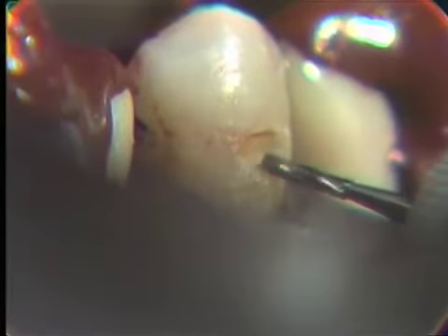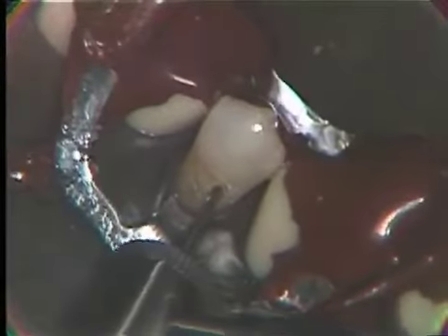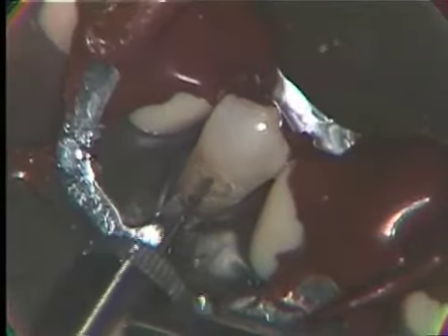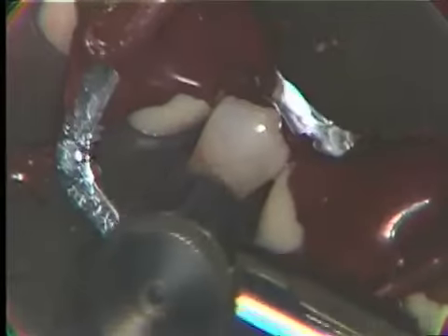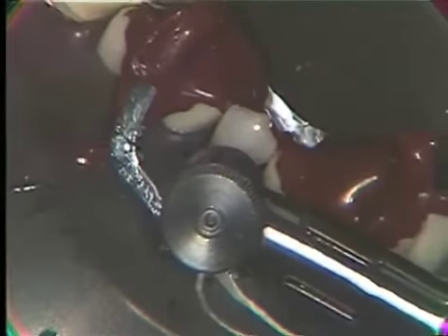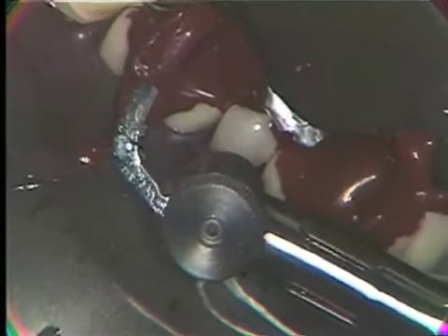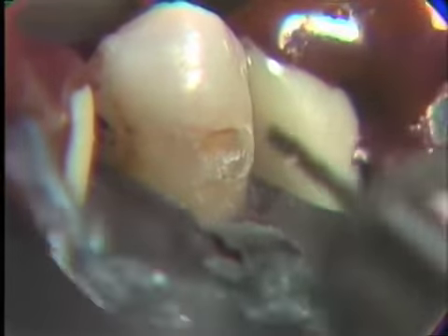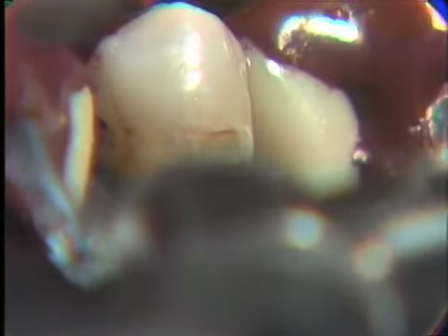Now, it's very important that you understand the direction that this bur is going to be applied to the tooth. We must not leave any unsupported enamel rods. So in a dry running fashion, we will want to tip our bur slightly cervical, and we certainly will want to tip our bur occlusally so that we impart quite a noticeable taper to that occlusal wall. Now, as we come to the mesial and as we go to the distal, we will tip our contra-angle to meet the cavo surface of the tooth and also to cause curvature to the axial wall. This in turn will protect the pulp.